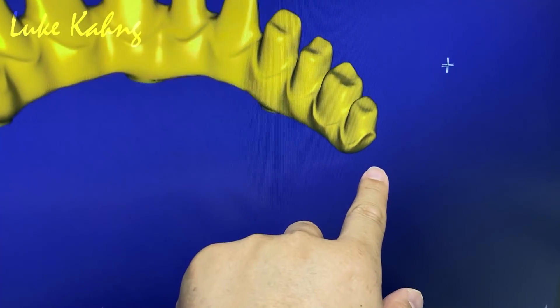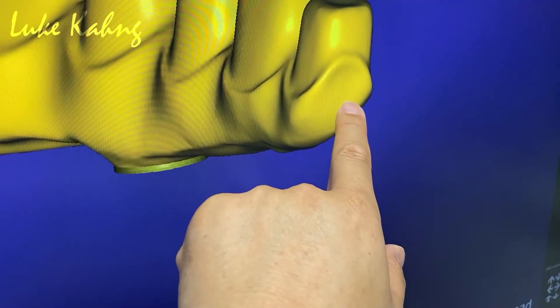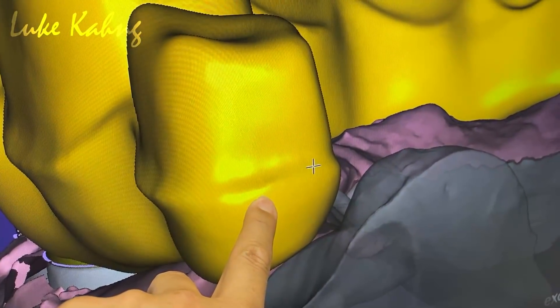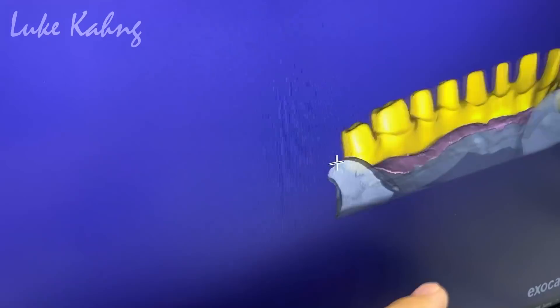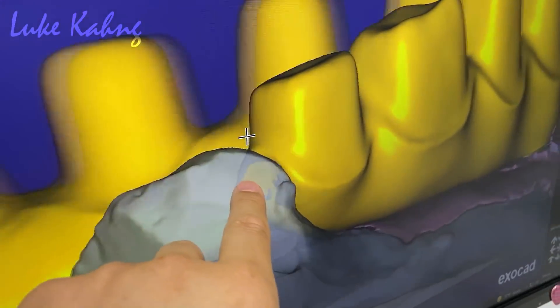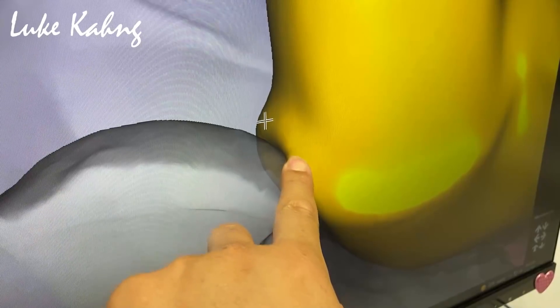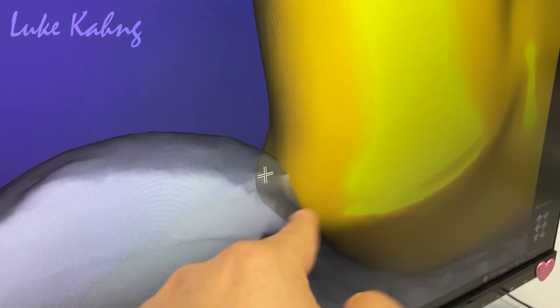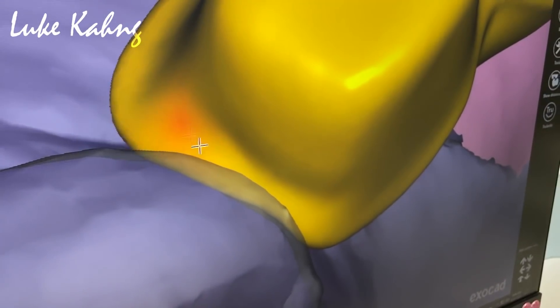So you can make it a little bit more down. That's the one touching the gum? Yes, touching. So okay, top over there. What about the other side? Make it a little bit longer. That's good. Let me see the other side. Maybe you can make it slowly a little bit down — halfway, because this is tissue. More down, slightly more down — nice. Make a deeper shoulder. So we just block that area. That's good.